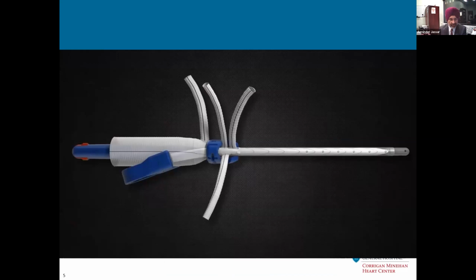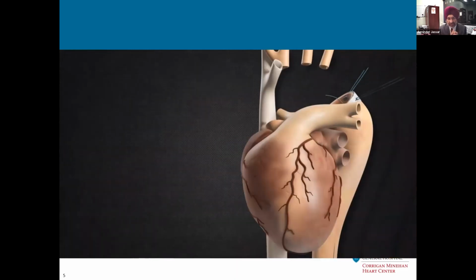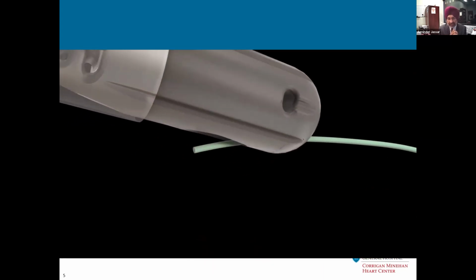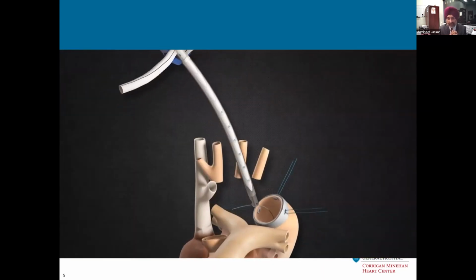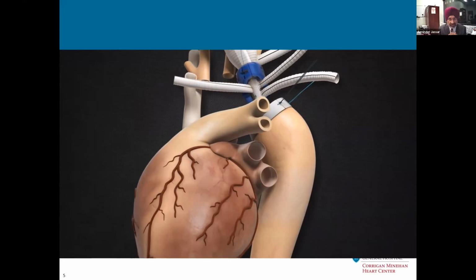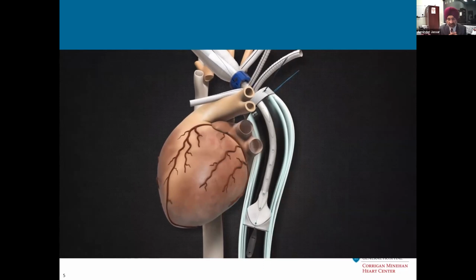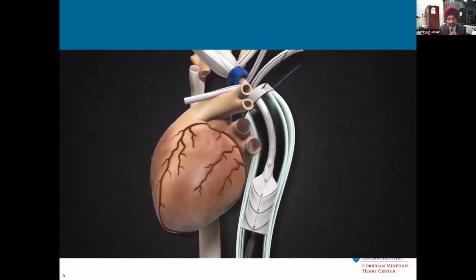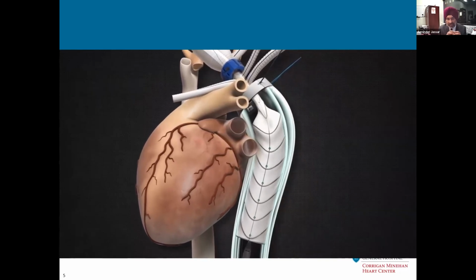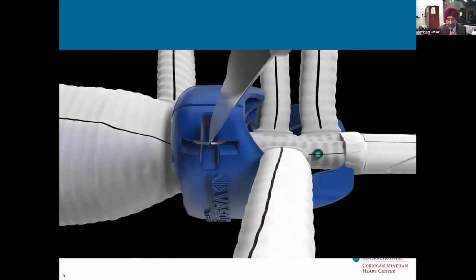This is a very short video of how this device is deployed. It's a flexible device that you can bend to the curvature of the aorta, done without fluoroscopy, and can be done actually with or without a wire to guide this. A wire probably helps, especially in a dissection case, so that you don't cross over the lumens. The device is inserted into the distal open arch, and a pull of the handle deploys the stent graft portion of the device. So the difference, rather than doing a standard elephant trunk, where we'd be using the standard devices, which are really long and meant for endovascular deployment, is that this is a short device that can be easily managed.